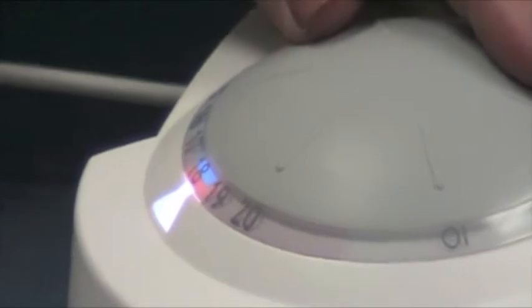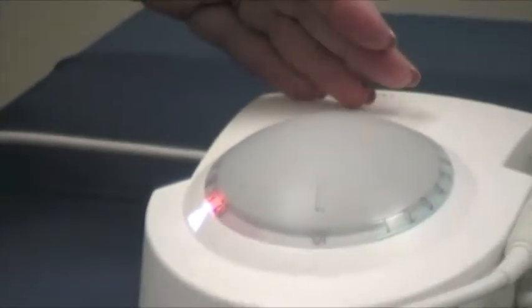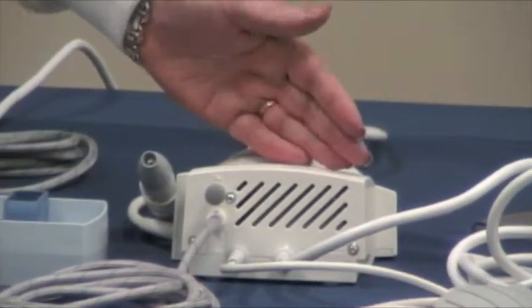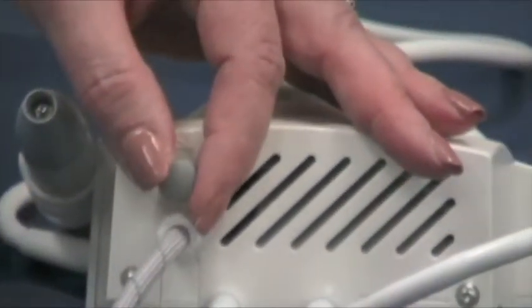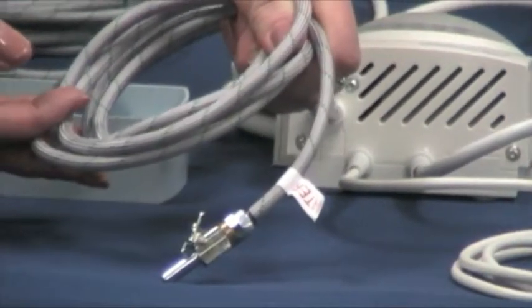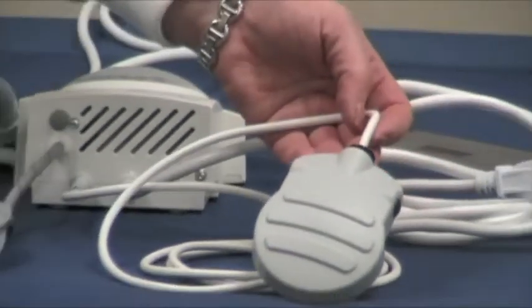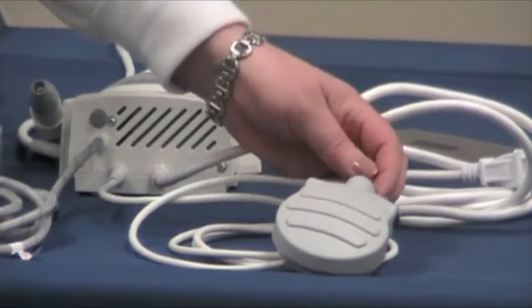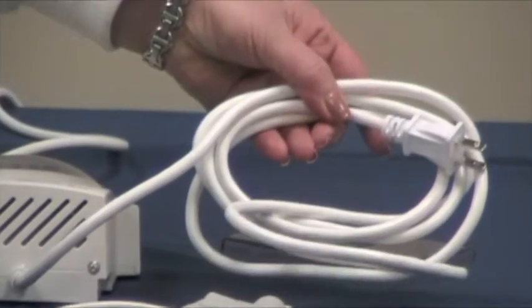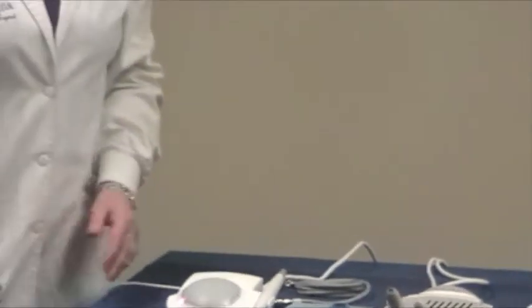Our last setting is orange — that's very high, and that's for crown and post removal. I'd like to move over to the back of this unit and show you the water adjustment level, the quick connect water, our rheostat or foot pedal, and our electrical cord. These components make up our first line of ultrasonics, the P5 Neutron.